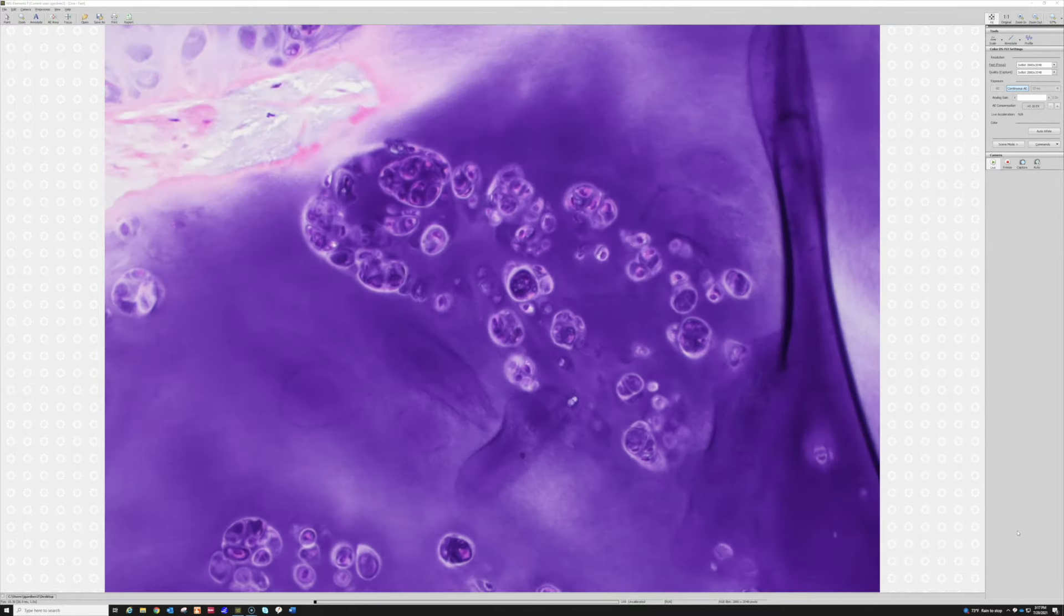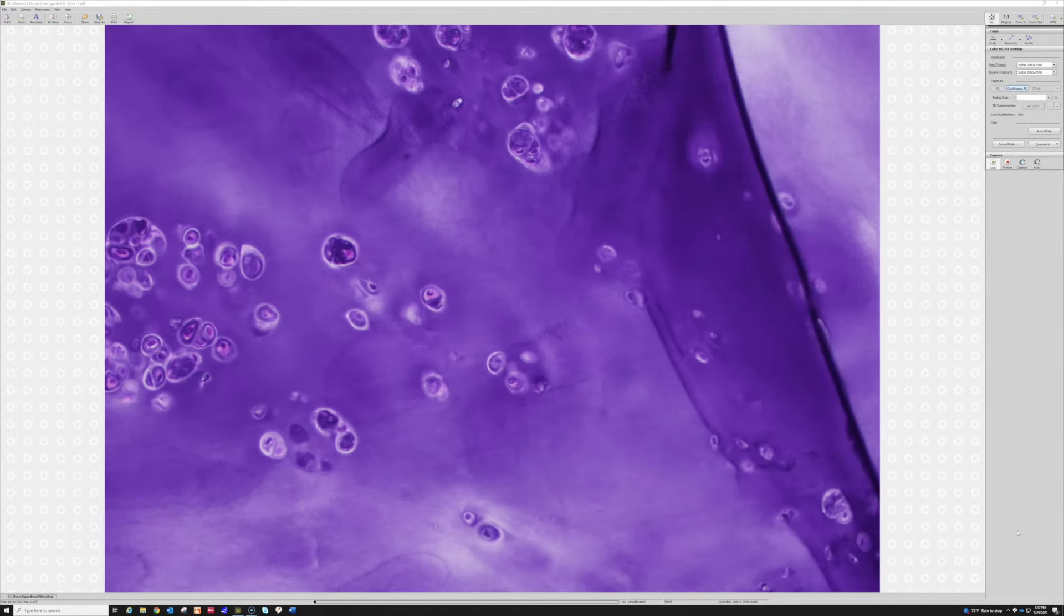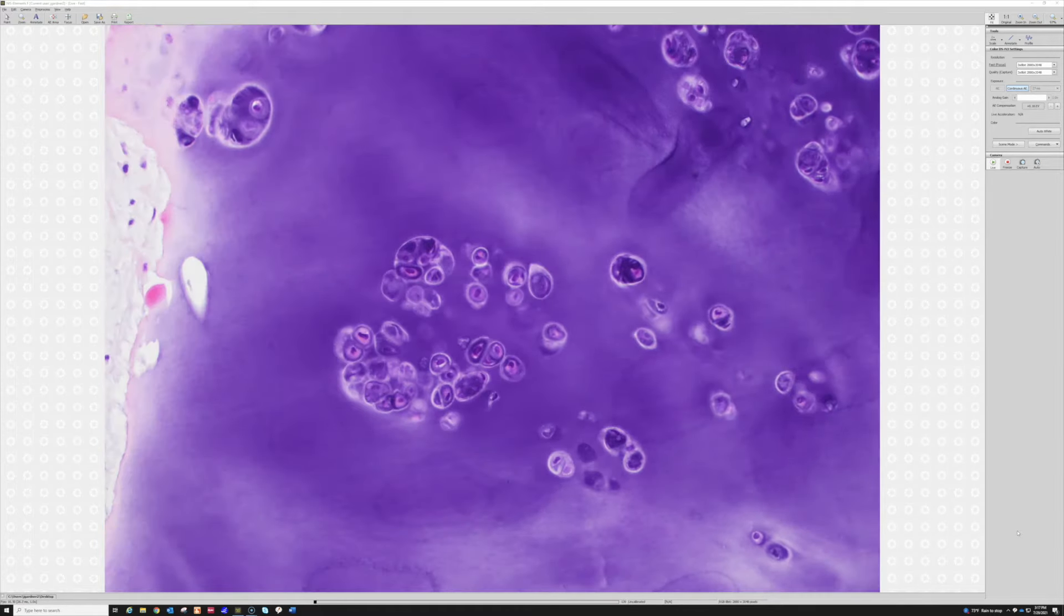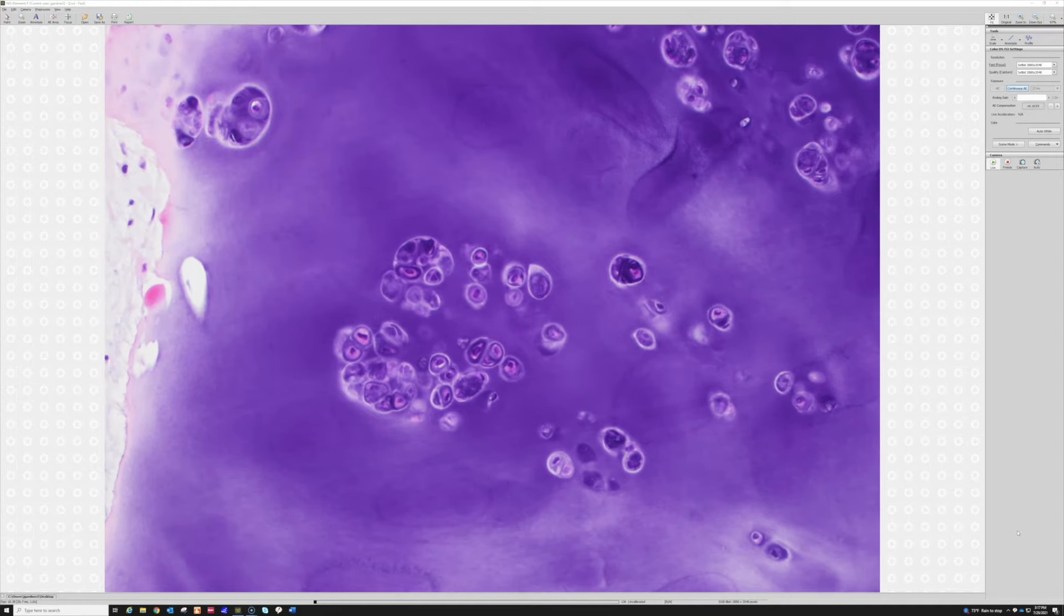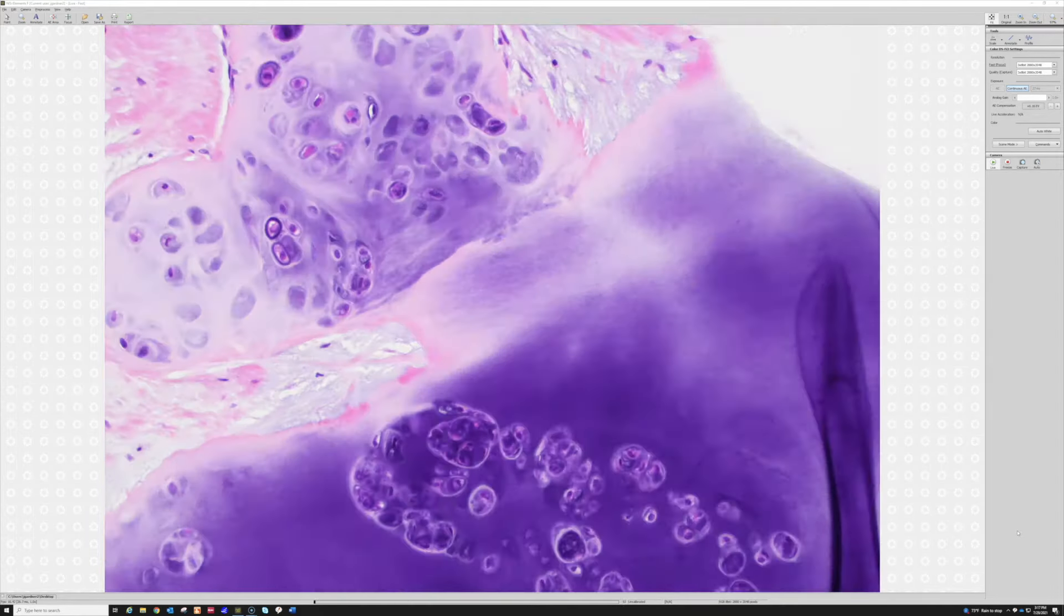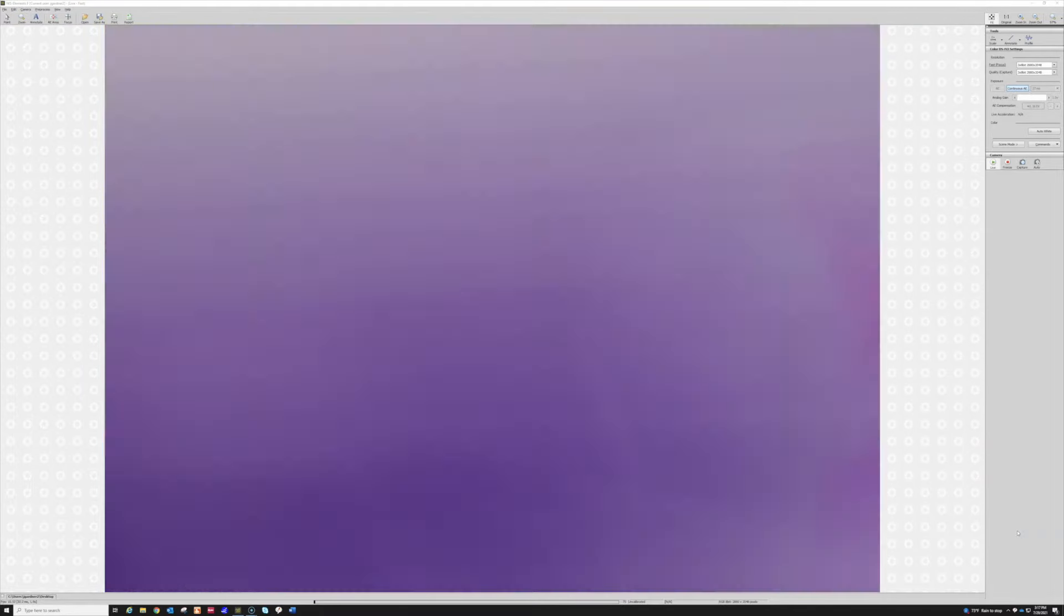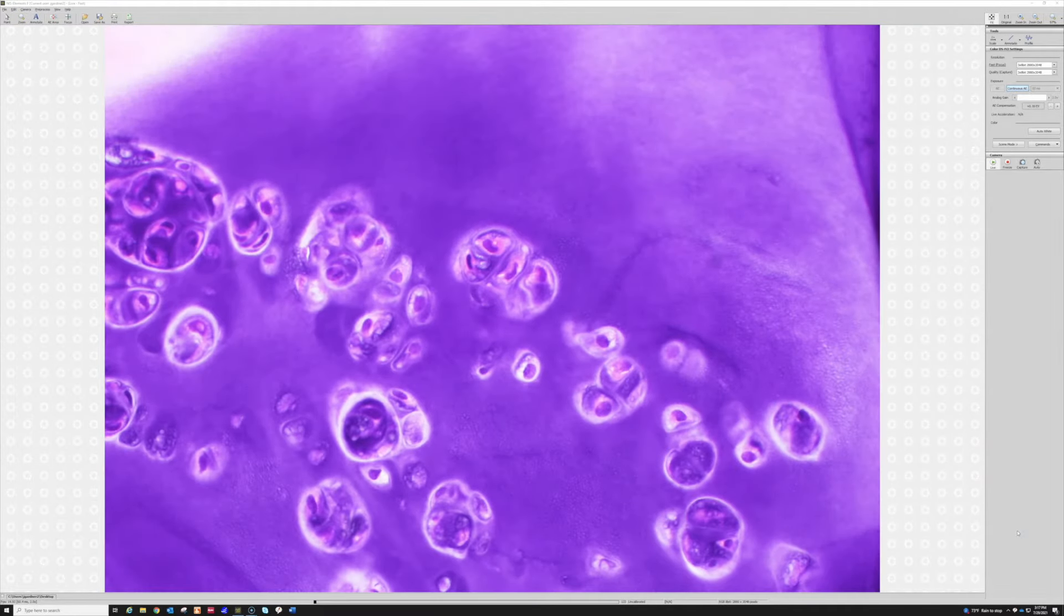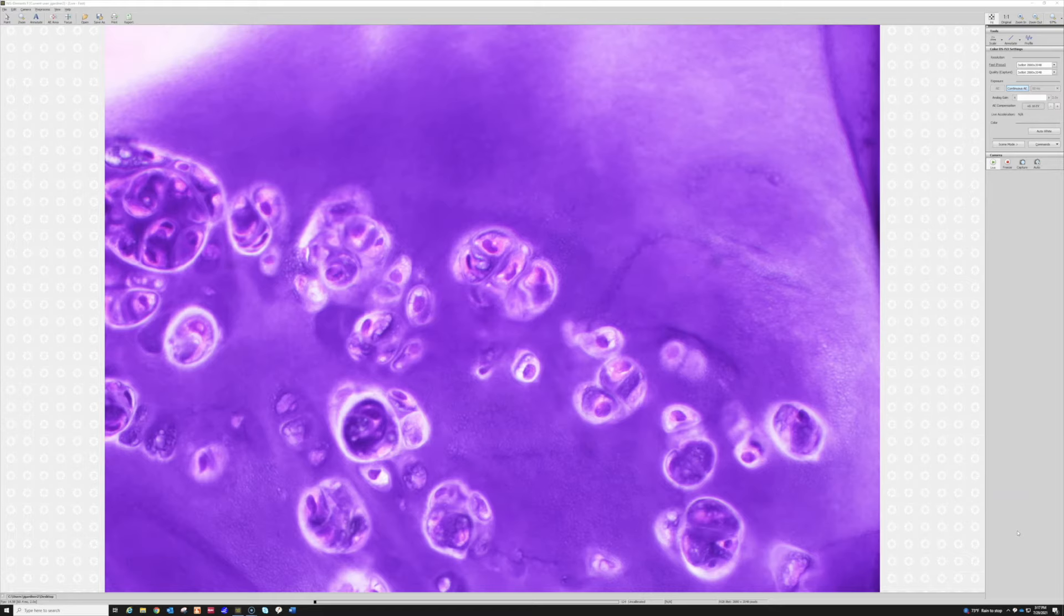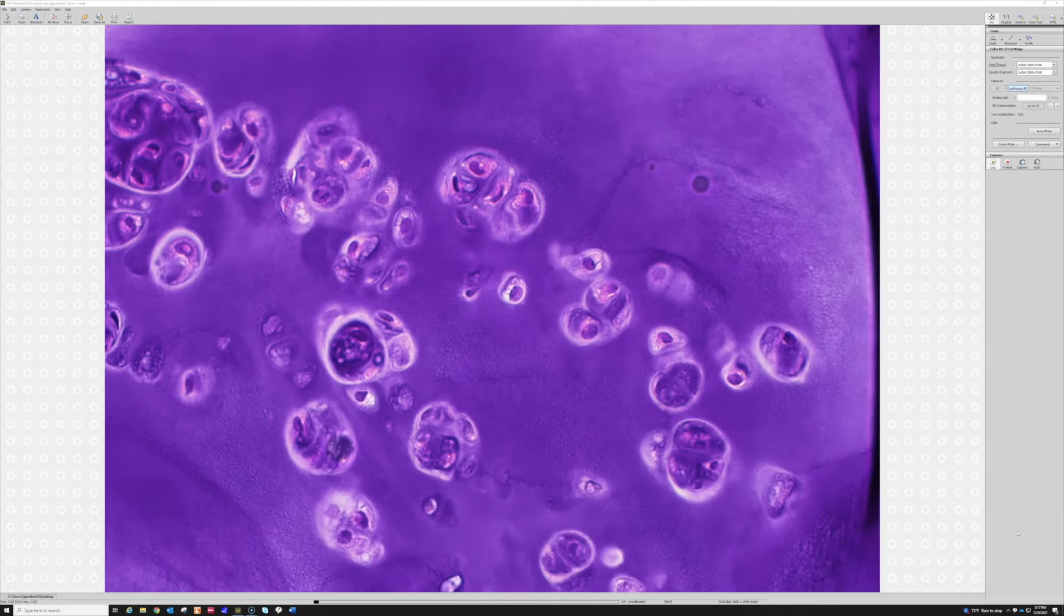But I feel like it's the most dramatic in synovial chondromatosis - these little proliferating clonal nodules of chondrocytes. It's a little hard to be able to see the nuclear features because the background matrix is so blue it often obscures them.